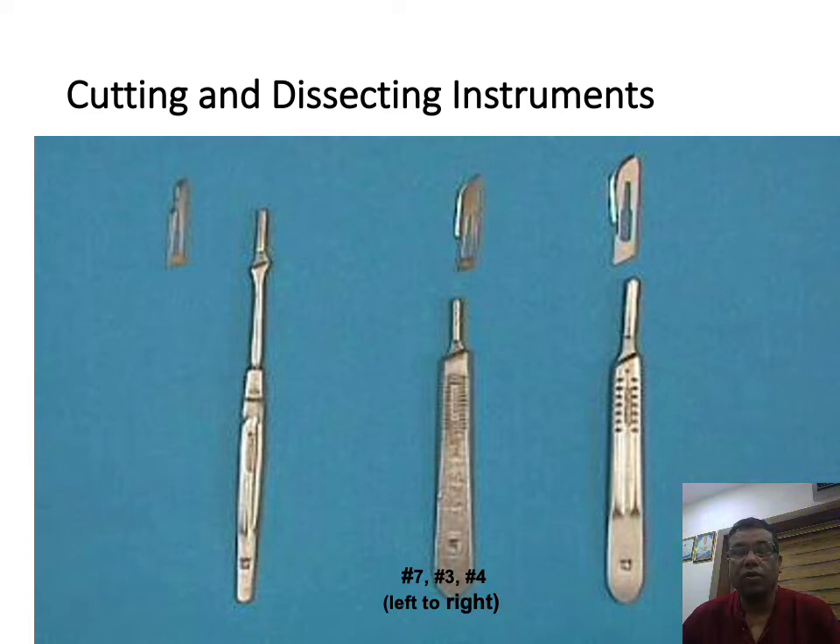Now we will see some instruments which are important, which can be quickly scanned through. I am going to show you the instruments and the probable question will be where it will be used. This is a BP handle and blade. The normal BP handles that are used are number four, number three, and number seven.